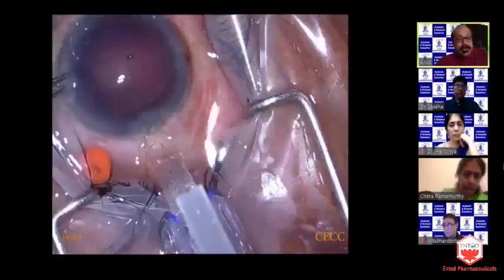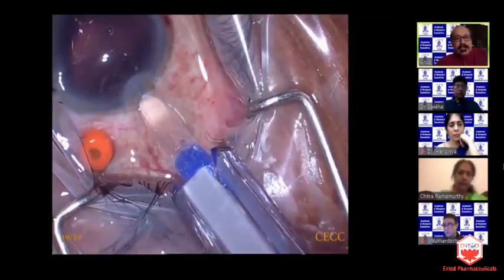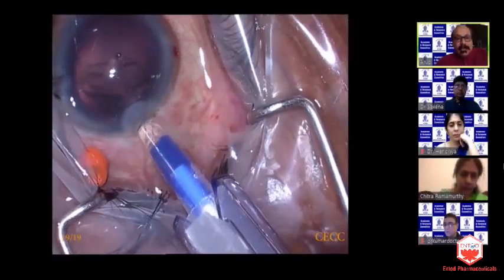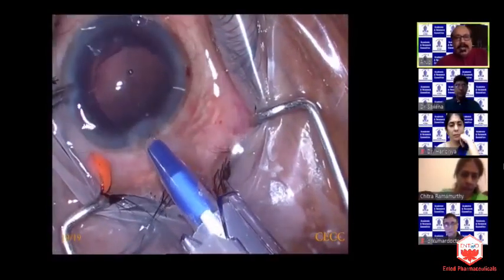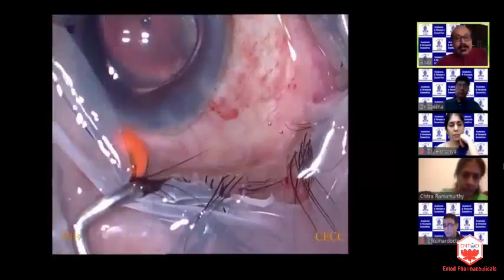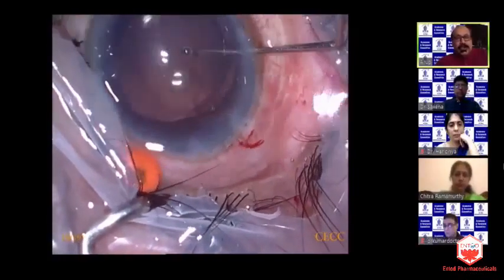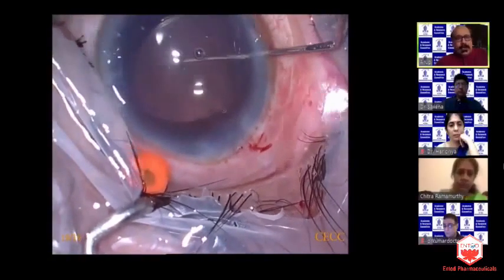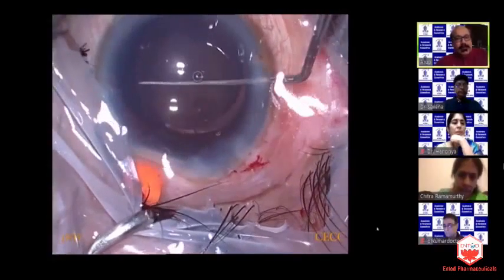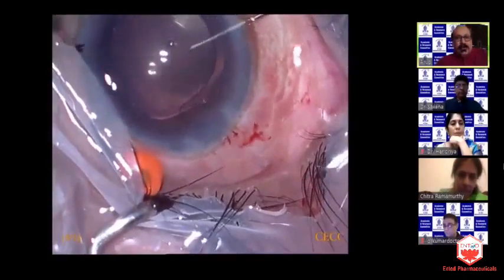Was it aqueous misdirection? It was not aqueous misdirection, because the intraocular pressure went up before I started any irrigation maneuvers inside the eye. I did not do hydrodissection when the pressure went up, there was no irrigation aspiration going on, and no hydro polishing of the posterior capsule. So all those conditions have been ruled out. Was it a capsular rhexis block? No, because the pressure went up even before the hydrodissection was performed, even before the rhexis was performed.